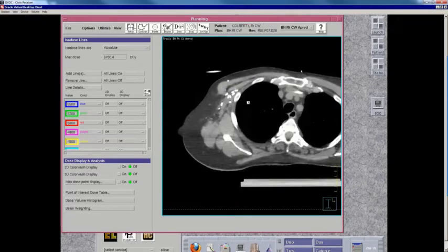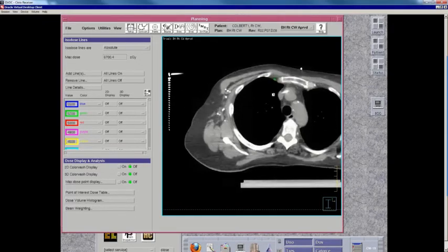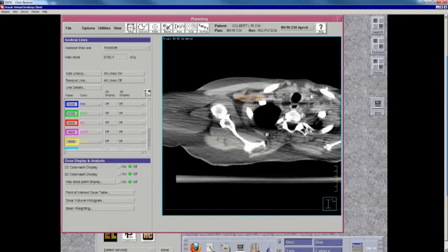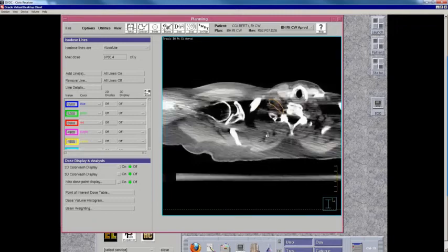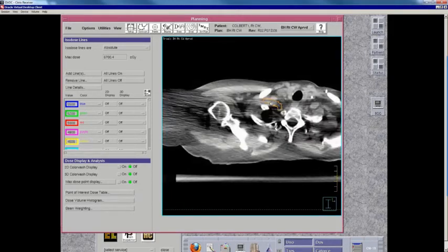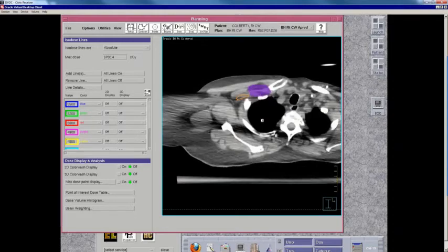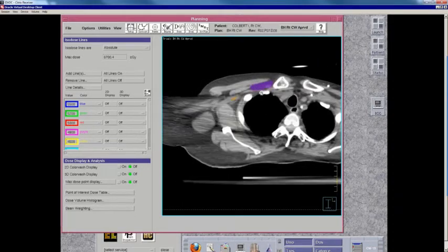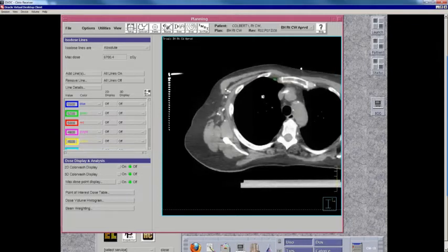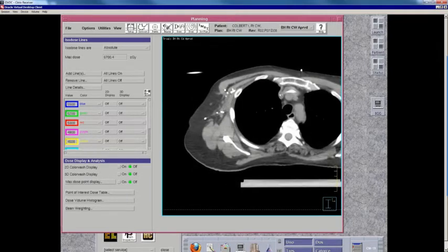And then we contour the internal mammary lymph node. Oh, in this patient, I'm not sure if I contoured the supraclavicular nodes or not. Looks like I did not contour the supraclavicular lymph nodes, but I definitely intended to cover them completely. We have an auto contour for the brachial plexus to keep track of that dose. And then we also contour the IMC vessels. So here's the IMC vessels coming off of this artery.